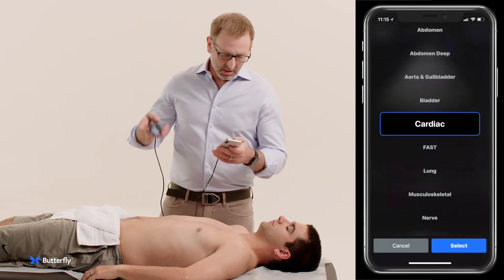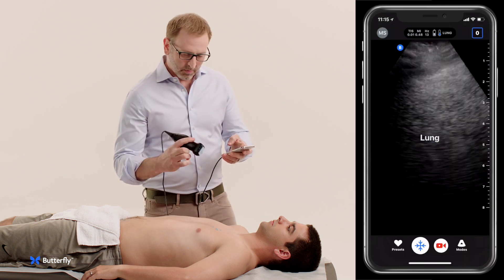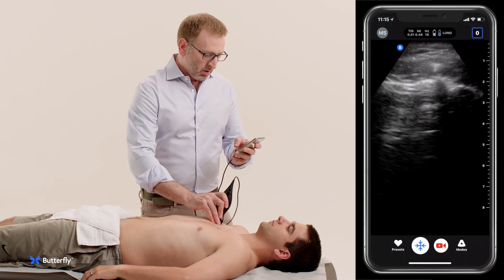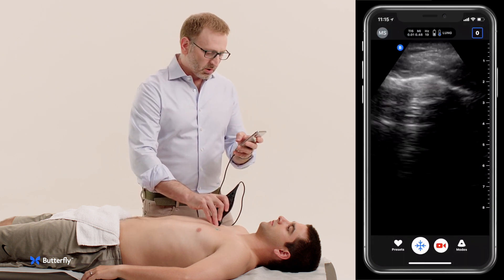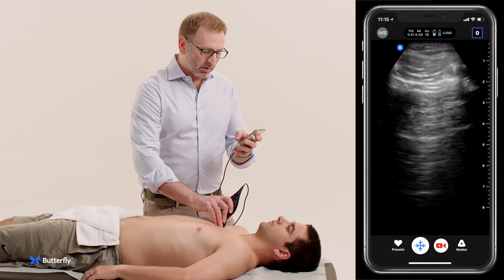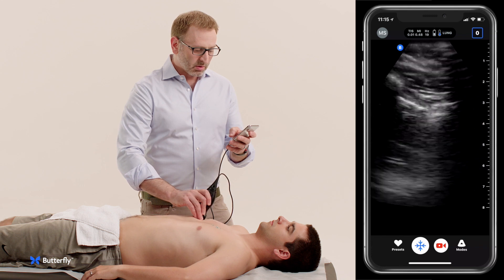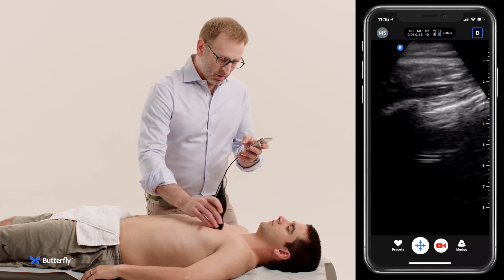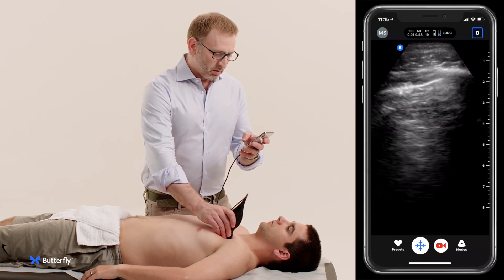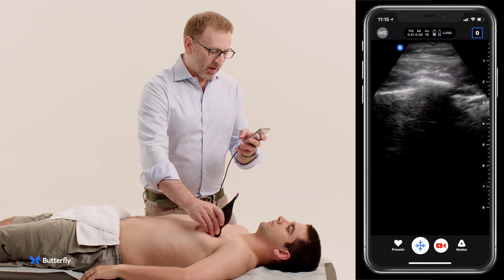We switch to a lung preset and apply the IQ with the indicator towards the patient's head in the right parasternal space, identifying the pleural line and lung sliding, looking at several intercostal spaces, then moving on to the left and identifying lung sliding on the left.